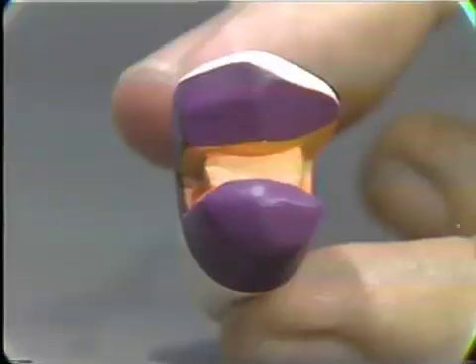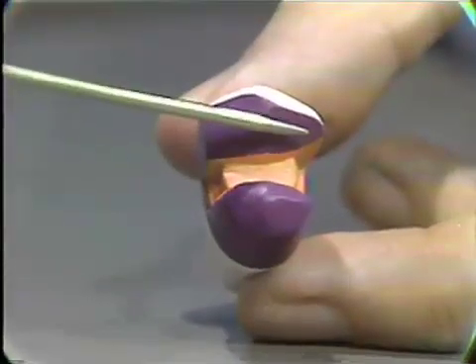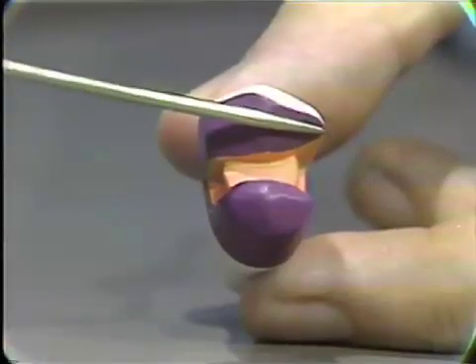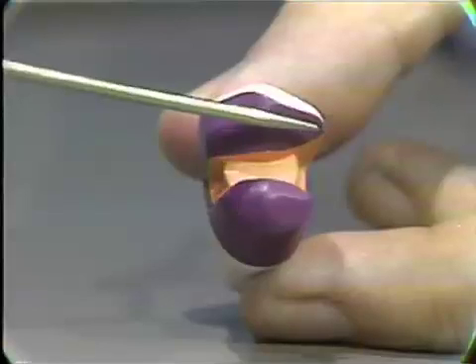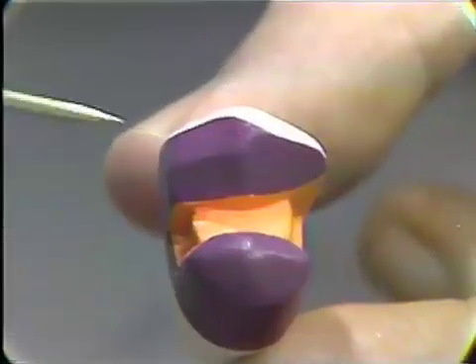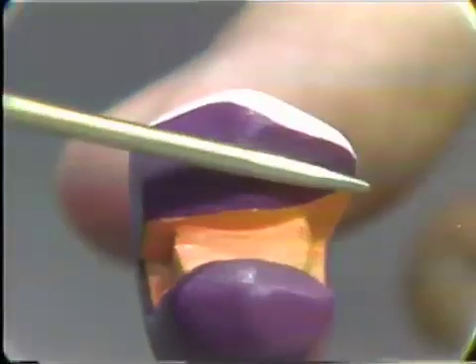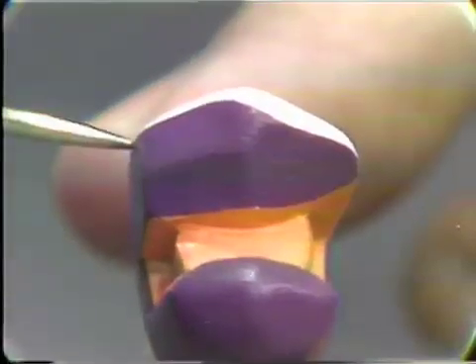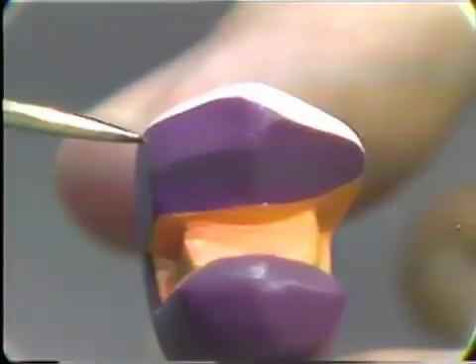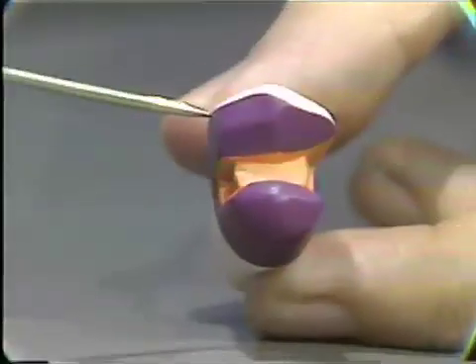Now this is a maxillary bicuspid tooth, and the box preparation is done on the mesial because it gives greater control over the extent of gold showing on the mesial surface here. I think you can see, comparing the position of the boundary on the buccal surface there with the one on the distal where the slice is here, that it's considerably more conservative in extension on the mesial than it is on the distal. Where you do a slice, it's necessary, of course, to go this far out in order to get removal of the external undercuts of the tooth, which is so essential.